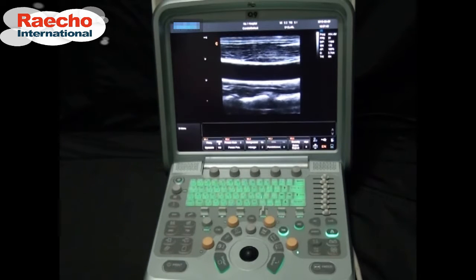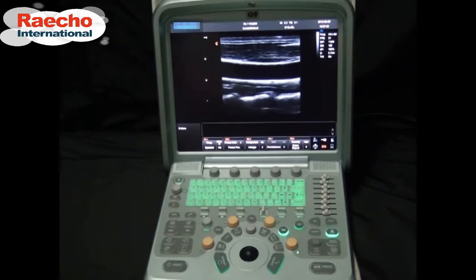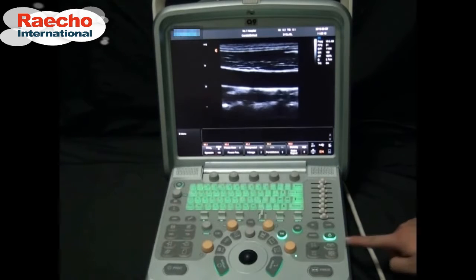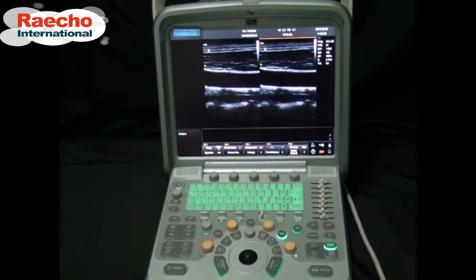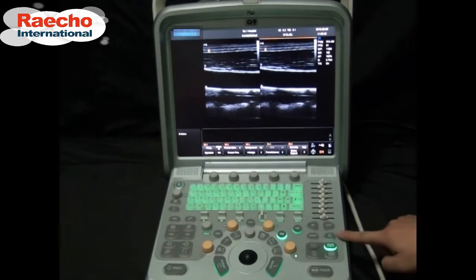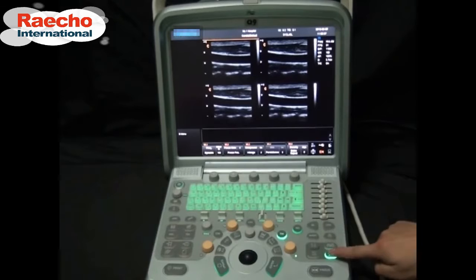What's more, as I mentioned before, one key to optimize the image is available. Press AIO. With just one key, the image quality can be brought to a suitable status. What is worth mentioning is that we have 2B mode and 4B mode. For example, in 2B mode with dual screen, click for the first and get one active. Push it again and the next becomes active. Back and forth allows you to switch between those. Push the single key to go back to single B mode. The same works for the quad screen.